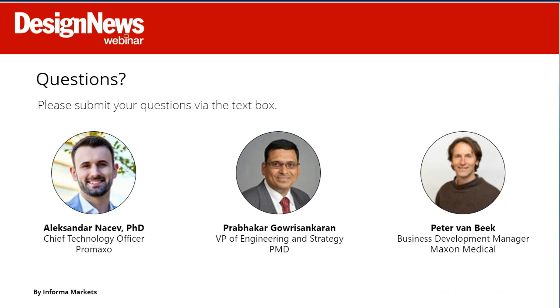Okay, excellent. Also wanted to ask, what are the benefits of distributed versus centralized motor control in cobots or robots? Yeah, so some of the traditional, like the large ABBs and KUKAs of the world, a lot of them have done centralized, where there's a big controller, where all the controls are done in the outside box, and then they're just sending position, velocity and time kind of parameters to each of the drives at the axes. So all the brains are in a central place.